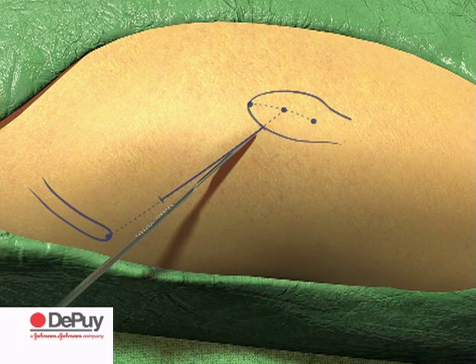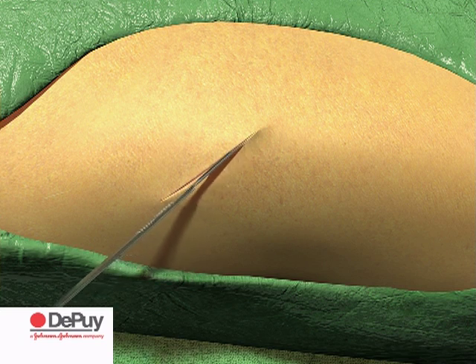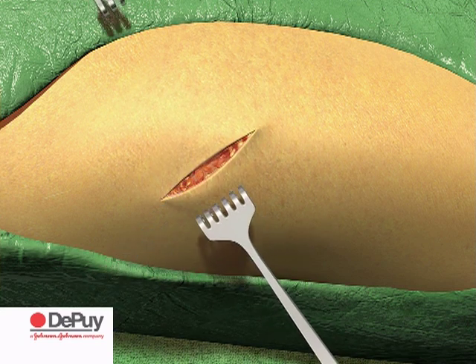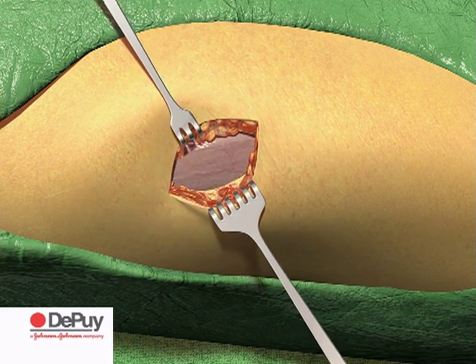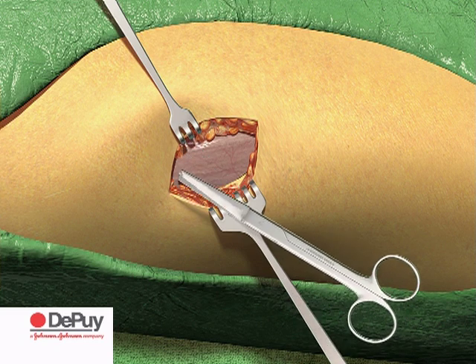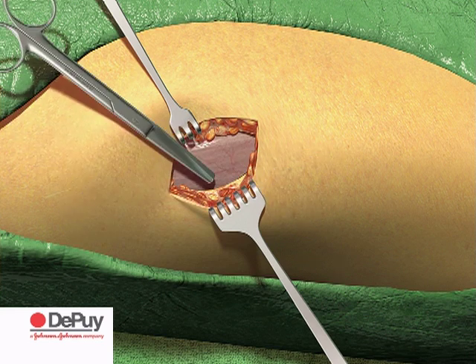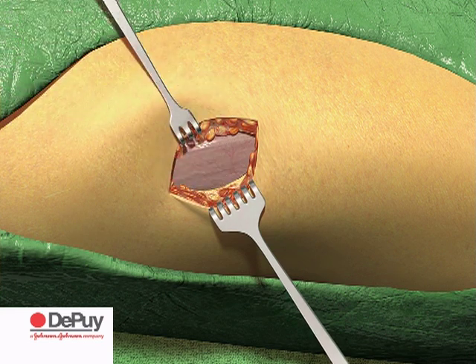Make an initial skin incision and then divide the fatty layer in line with the incision. Lift the skin and undermine the fatty layer to create a mobile window sufficient to expose the capsule, but not so extensive as to risk necrosis of subcutaneous tissue.